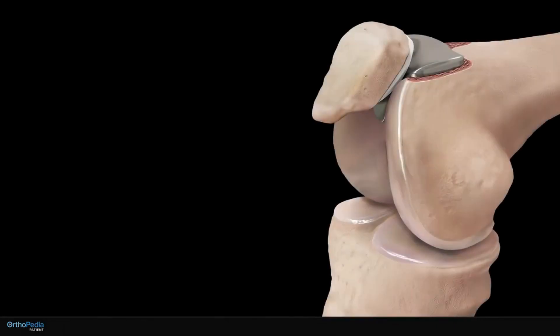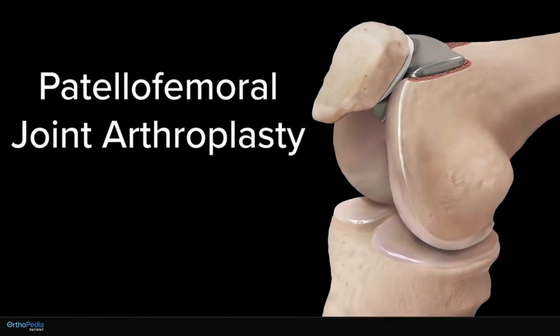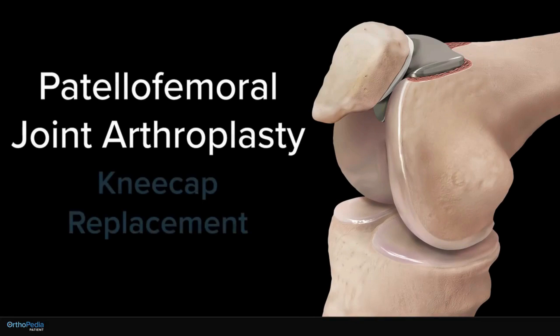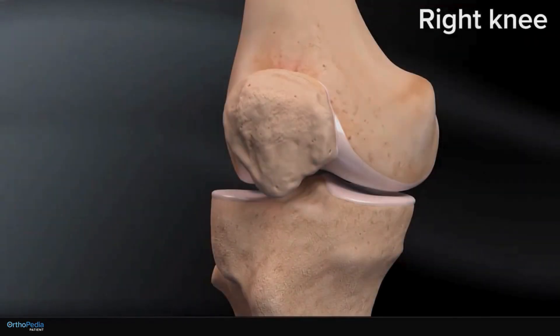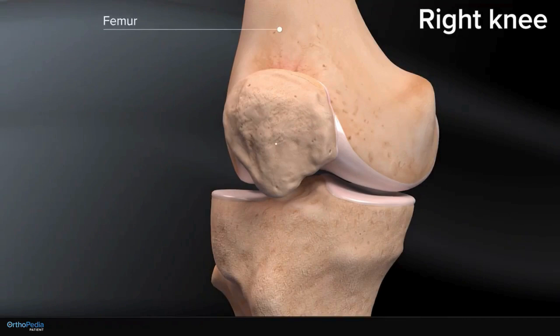This animation demonstrates a patellofemoral joint arthroplasty, also known as a kneecap replacement, for the treatment of knee arthritis. Here we see a right knee joint consisting of the thigh bone or femur, patella or kneecap, and tibia or shinbone.